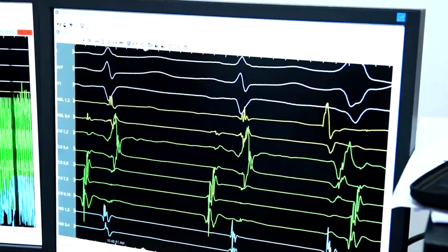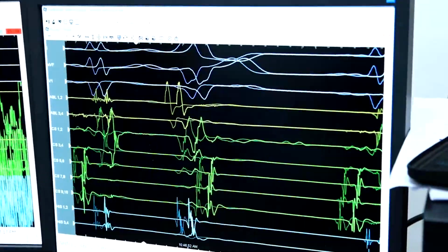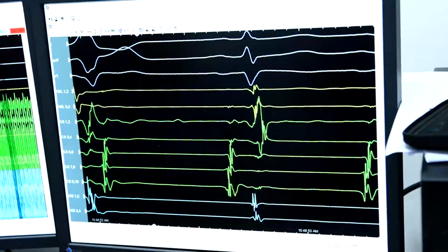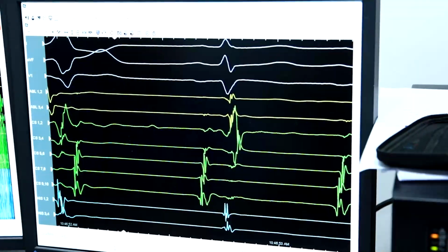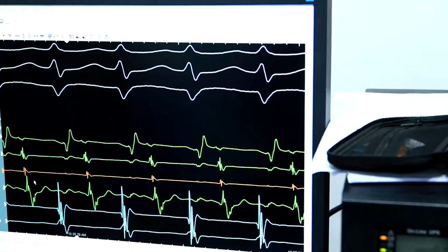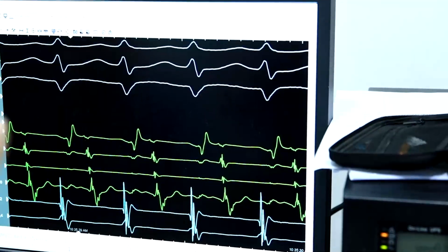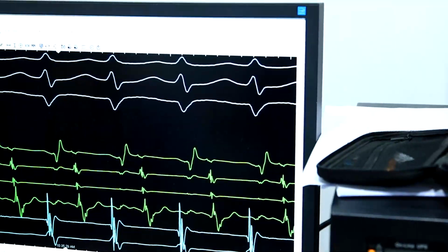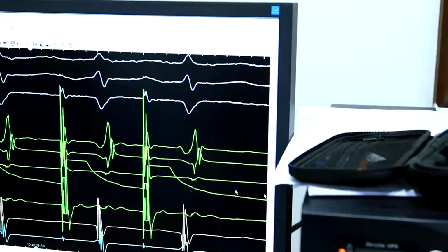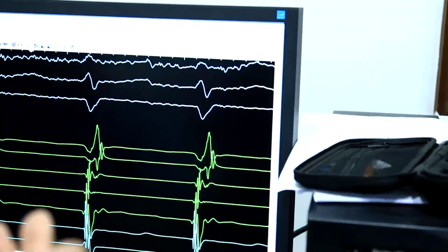Next, we kept inducing the other tachycardia. The second tachycardia was still inducible. So we did V pacing, and we had the earliest A signal. We know that the atrial electrogram is in the posterolateral region. I will show you some fluoro after that. We could entrain this tachycardia.